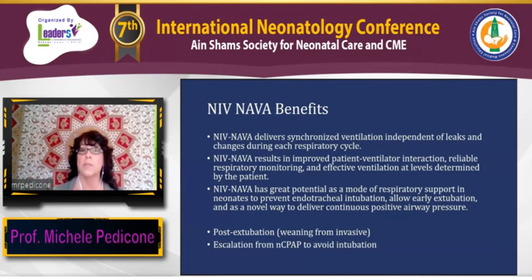And it has great potential as a mode of respiratory support in neonates to prevent endotracheal intubation, which is where, in my experience, the non-invasive NAVA has really shown its strength. When we've had a patient who maybe is not doing so well on a cannula or a CPAP type of device, we can switch them onto NAVA and we can monitor them more closely. And oftentimes, because it's more synchronous, and it also will provide a backup just in case. You always have that safety built in.